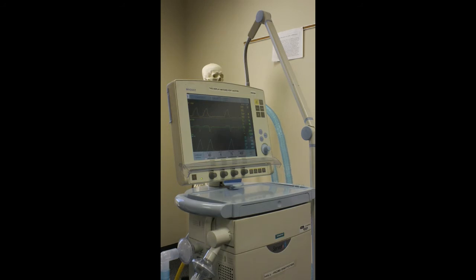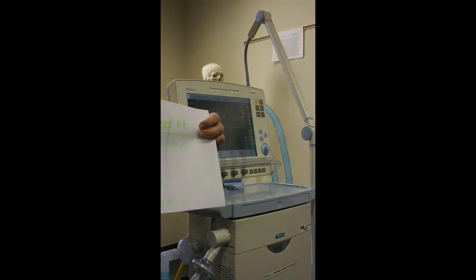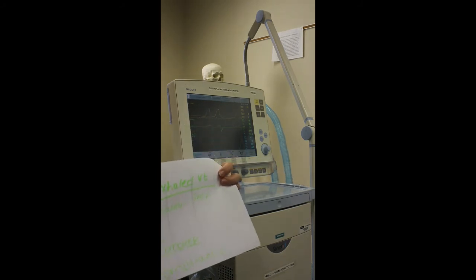I gotta remember to get that big old whiteboard thing in here. So exhale tidal volume divided by plateau minus PEEP is compliance. That's how you calculate it. Tidal volume divided by plateau minus PEEP.